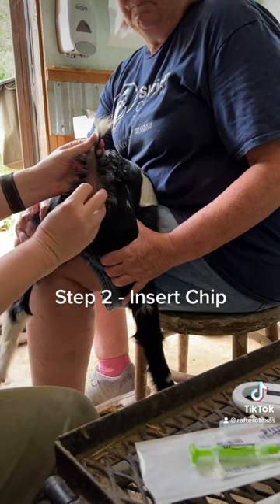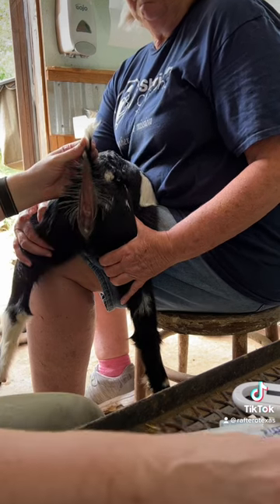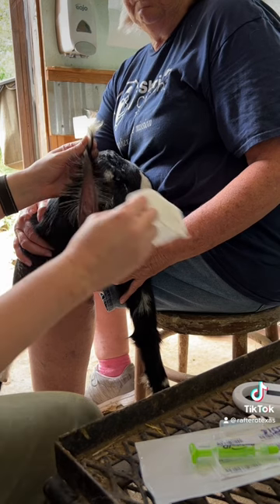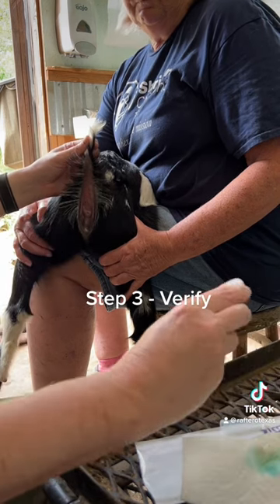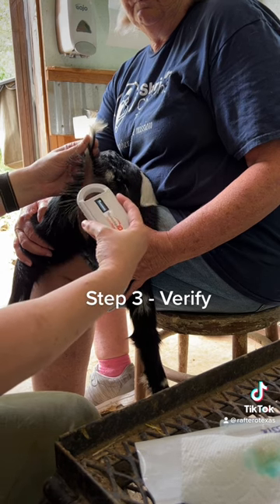Pull out. I like to pinch where it was. We can do a quick check — no bleeding there. Then we'll use our reader here to confirm that it is implanted. All done.